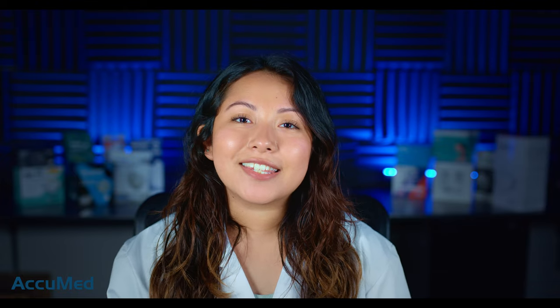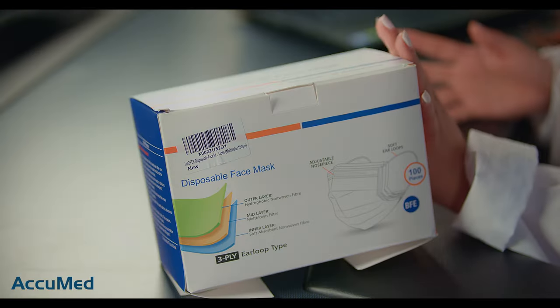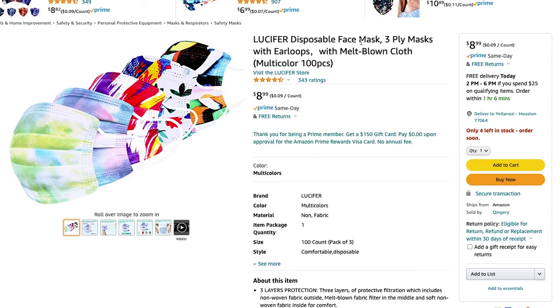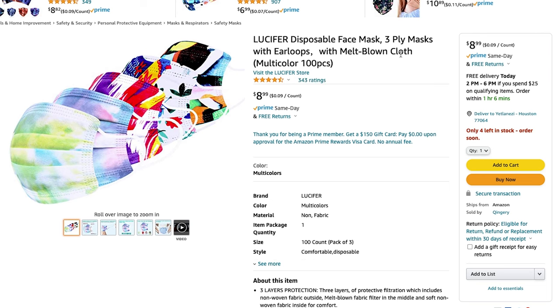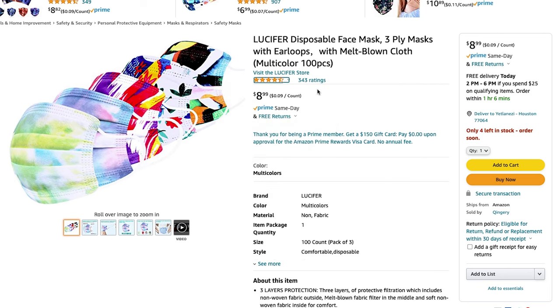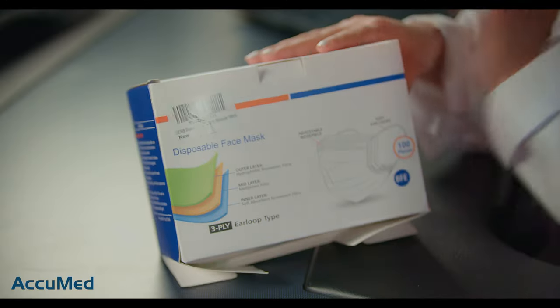Welcome back to the Acumen channel. Today we're going to be testing the Lucifer disposable face mask. The box looks a little rough but it came that way. Here is the listing: the Lucifer disposable face mask is a three-layer mask with a layer of meltblown, which is actually very interesting — we don't really see a lot of disposable face masks with meltblown. They come in a pack of 100 and are currently rated 4.6 out of 5 with 343 reviews. The cost is $8.99.